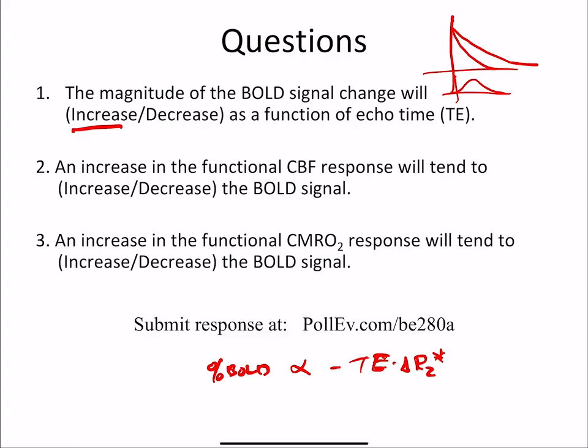Yeah, okay, so right, the question is the BOLD signal, we're looking for the BOLD signal change. So it's always a change between states. Yeah, so when we talk about the BOLD signal, it is an interesting thing. It's not really just that signal, it's actually how much the signal changes. Yeah, okay.